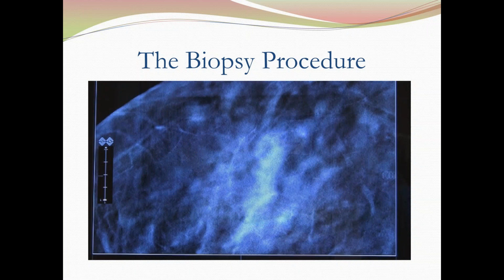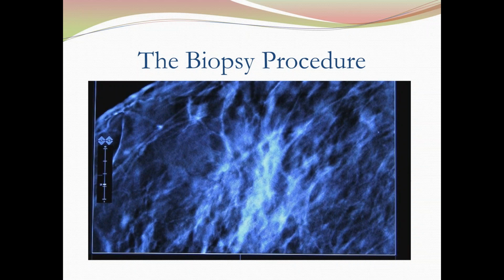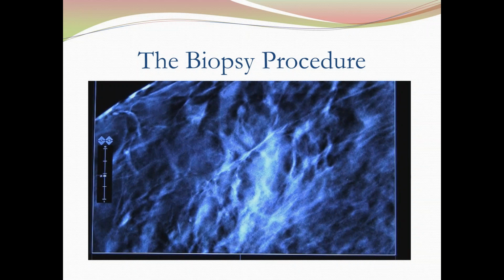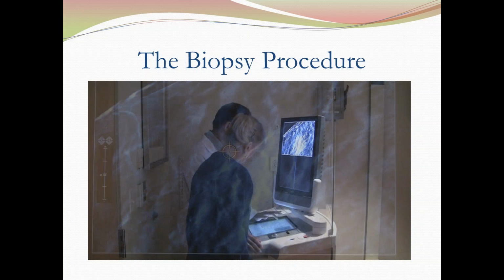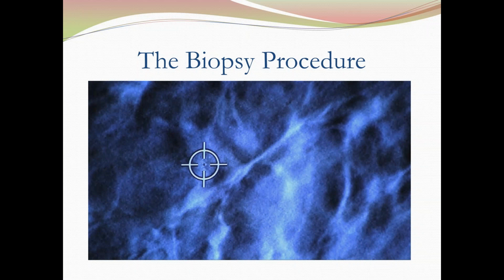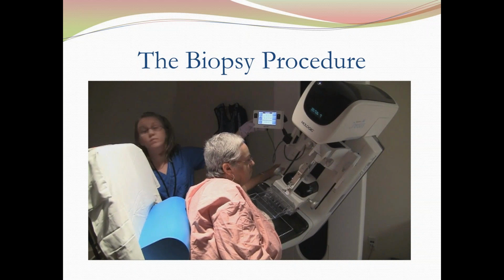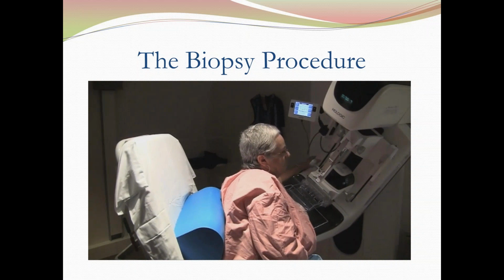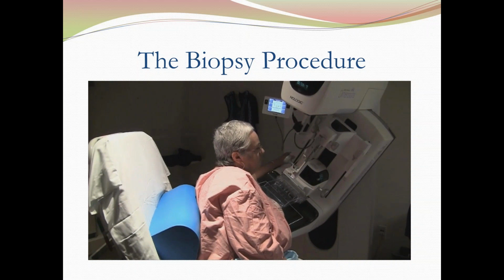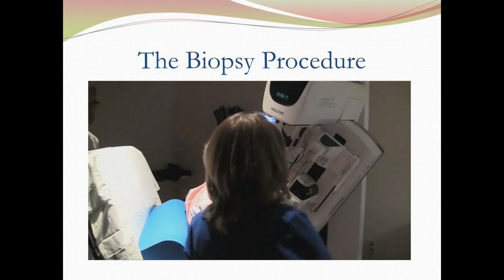And so I just put my cursor. This is me going through it, looking. You can see, I hope this projects well. Those are the calcifications. We put the target on it, and I send it over to the biopsy device. The technologist is doing the readback that we talked about, X, Y, and Z. She's doing a tomosynthesis here.